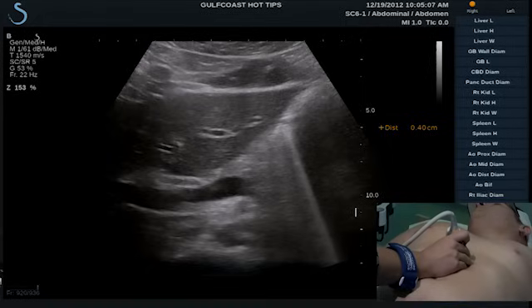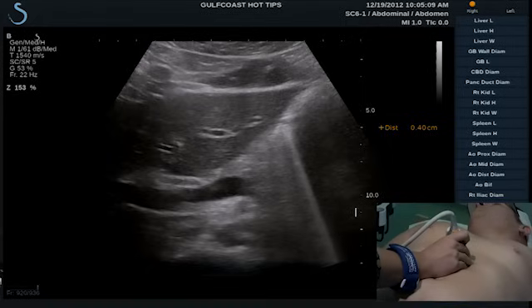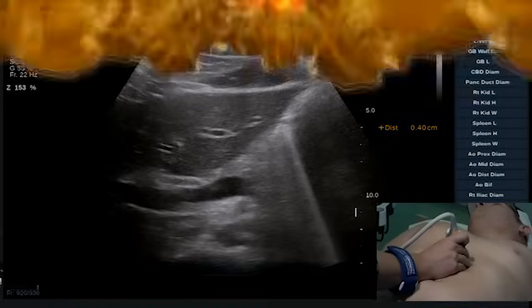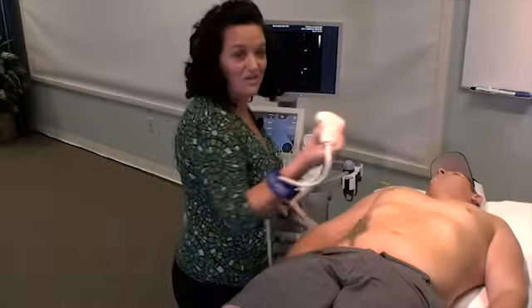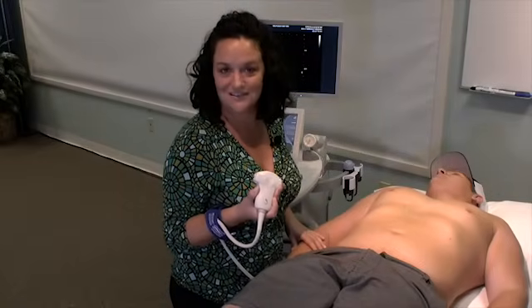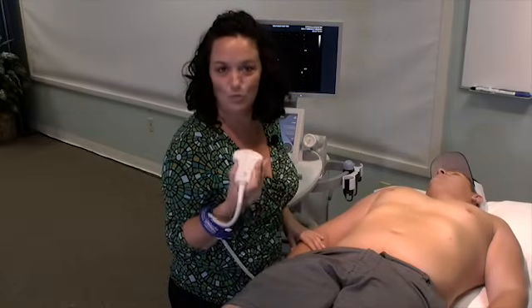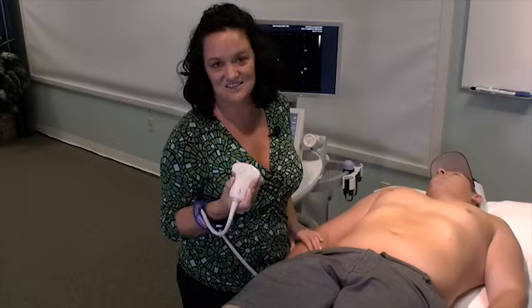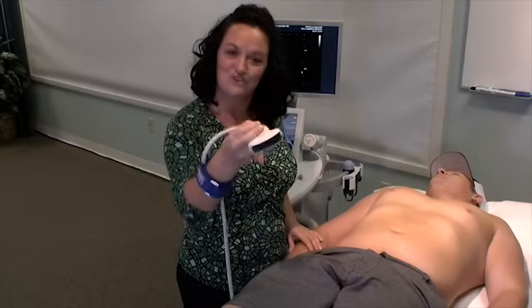Lastly, turning your patient to cubitus can always help alleviate and move some of that bowel gas. That's how you evaluate the common bile duct. I hope you've enjoyed this scan tip. Now it's your turn.